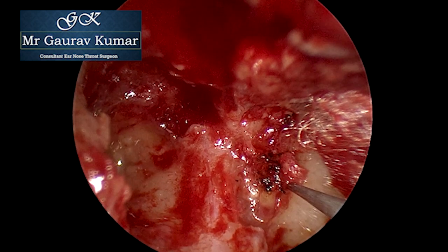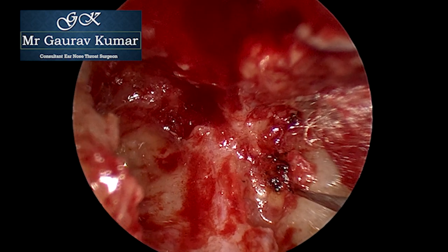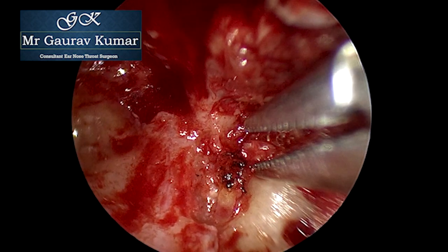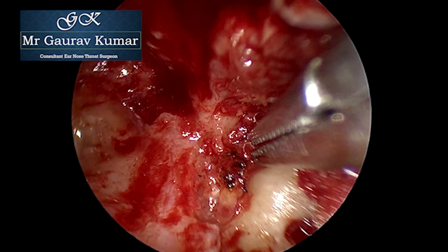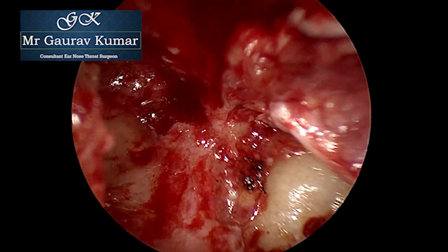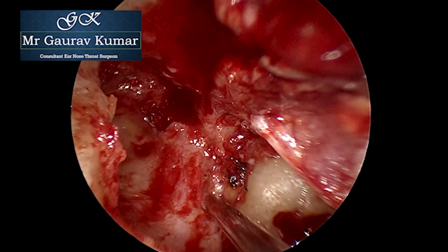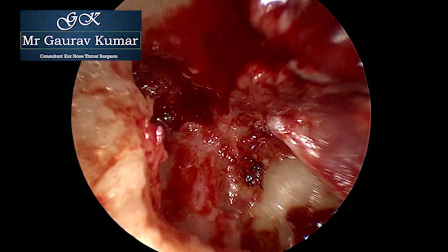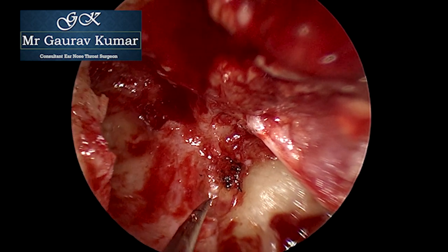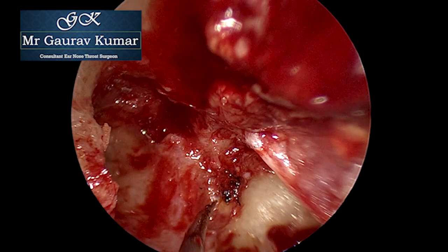The magnification of the Hopkins rod allows us to keep an eye on the footplate and lets us dissect in between the crura. Once the superior dissection is complete, the same step is repeated from the inferior surface. We keep going round in a circle, both on the superior surface, and then gently the sac is delivered, keeping an eye on the superstructure.